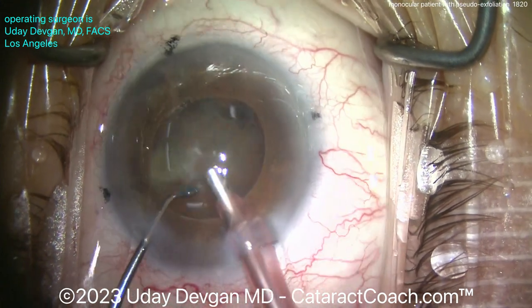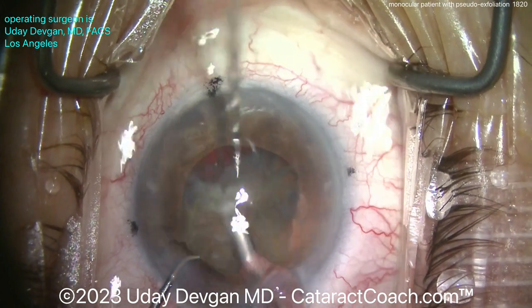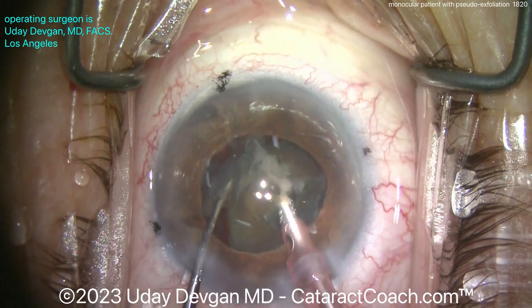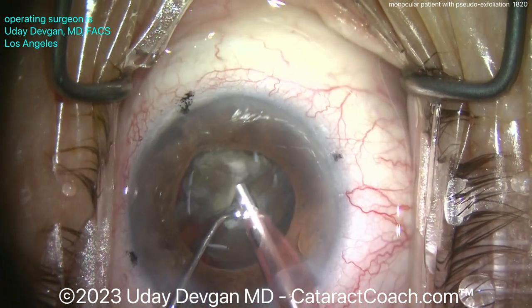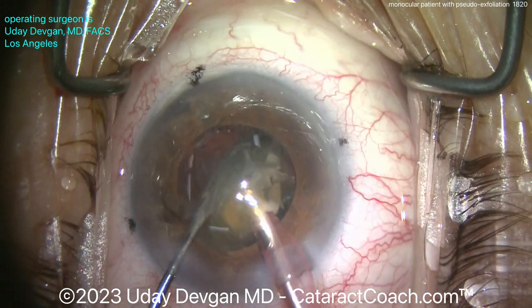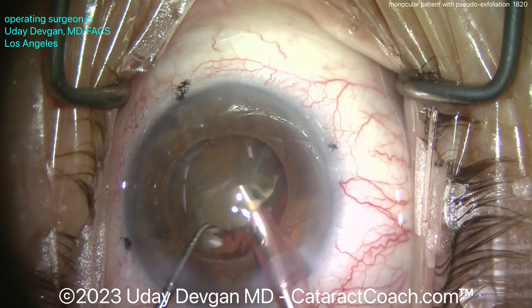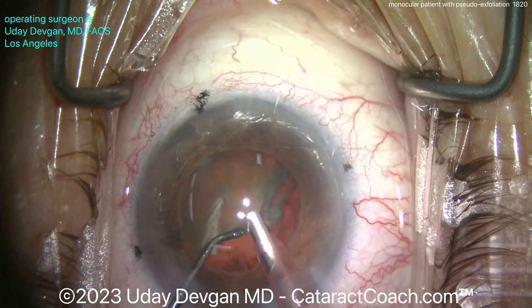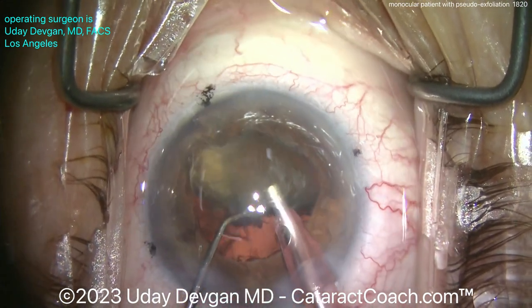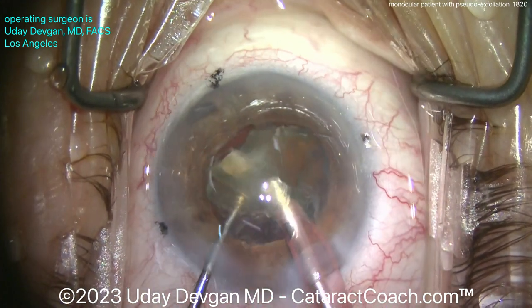Here comes the second half with the phaco probe. Let's sub-chop it — bringing it up. You can see how big this nucleus is compared to that pupil. Let's break off another piece, a little bit more chopping, nice and easy. We are using phaco power modulations to minimize phaco energy — pulse mode with a low duty cycle, only about 30% duty cycle. For more on programming your phaco machine, go to cataractcoach.com and look at the phaco fundamentals section.